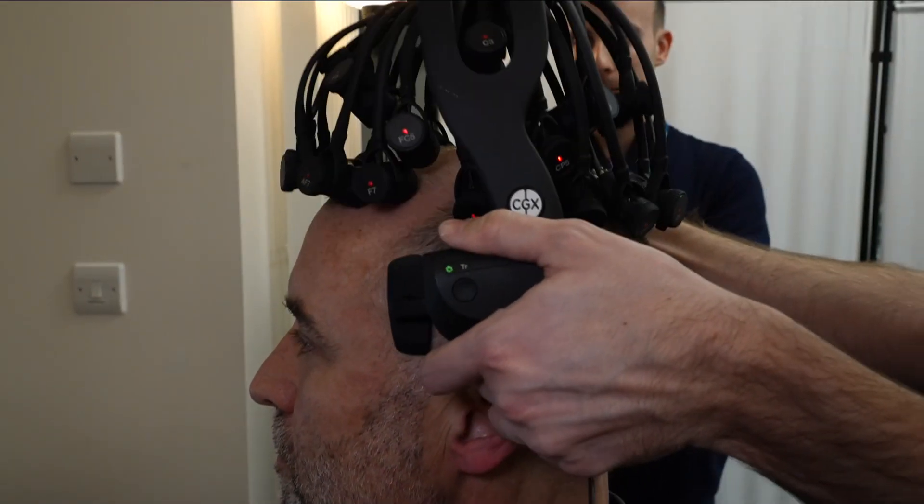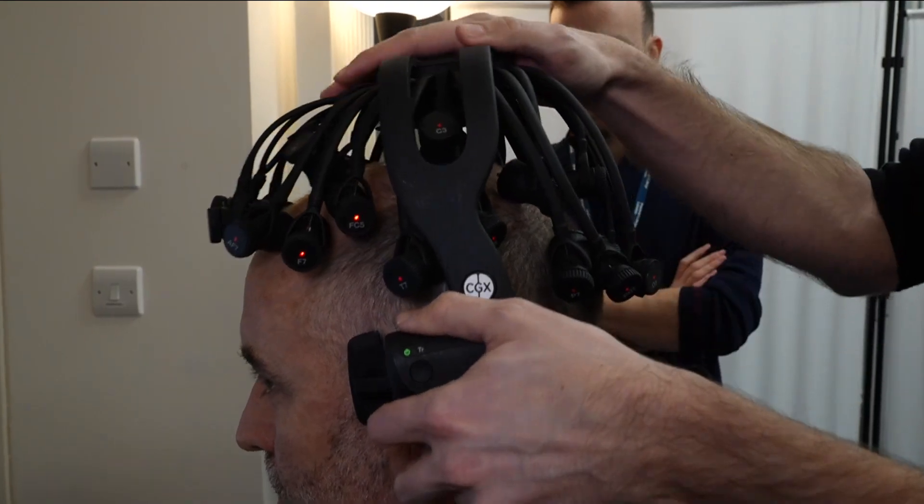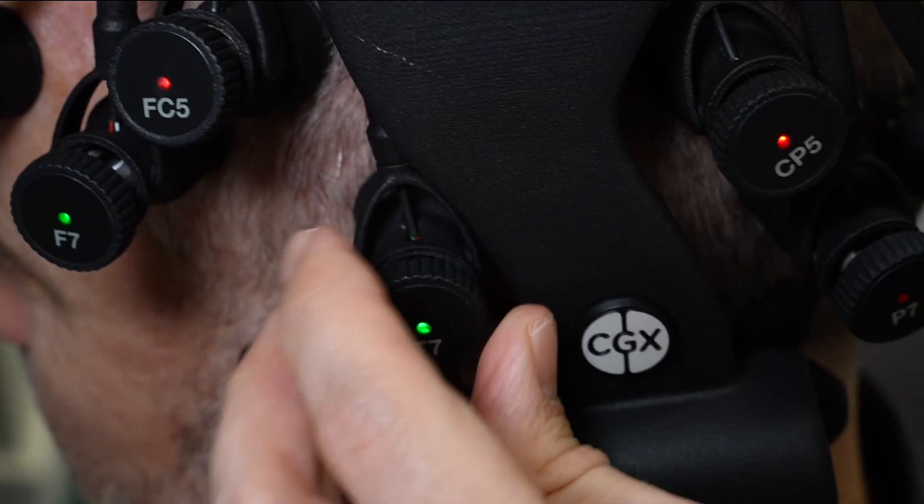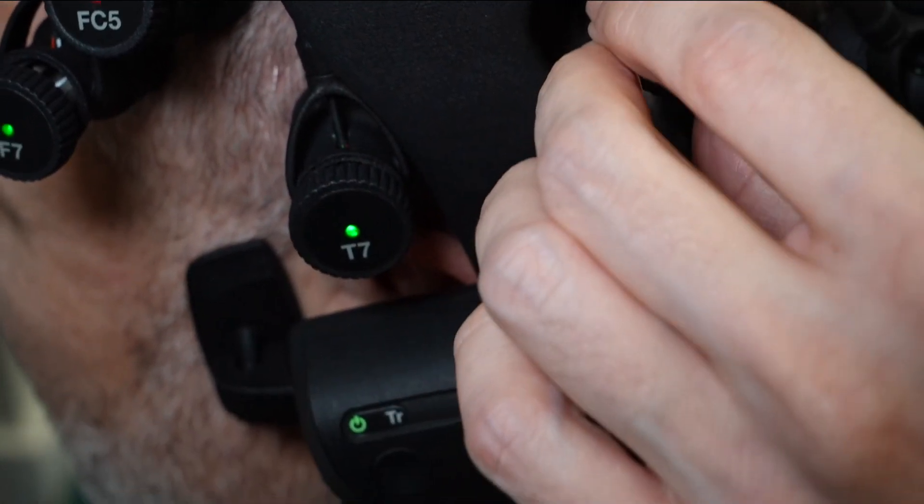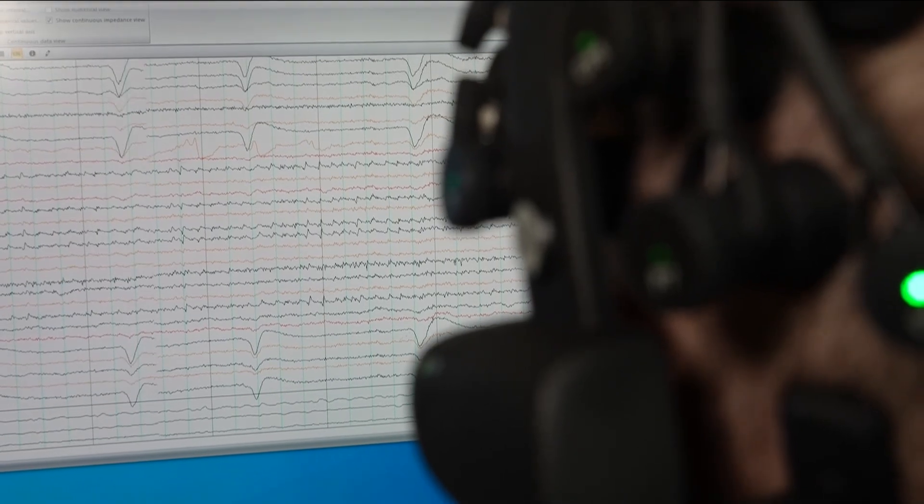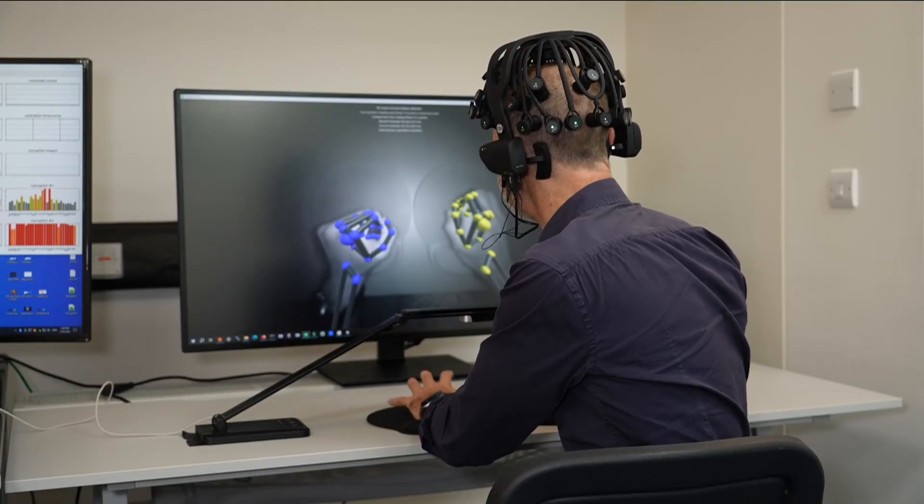And there are other ways to read people's minds. In this lab at Imperial College, I'm being fitted with a headset that measures my brainwaves without scalpels, even needles.